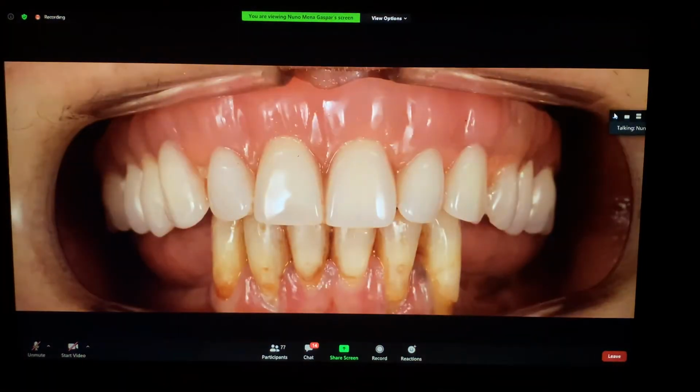So, and when she showed this, I understood that first of all, the occlusal plane is not correct, and this for sure is not correct either. Bệnh nhân thì bị sưng đau và có hôi miệng, và mặt phẳng nhai thì đang không đúng. Why?